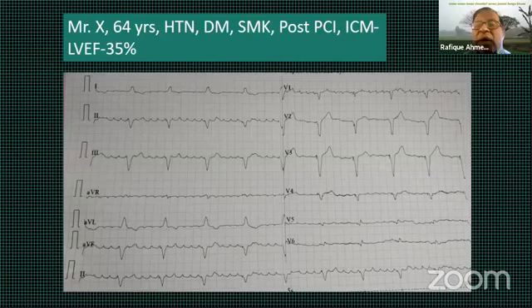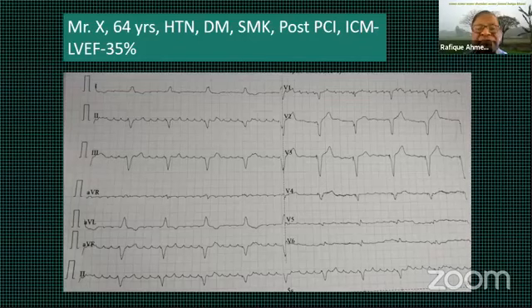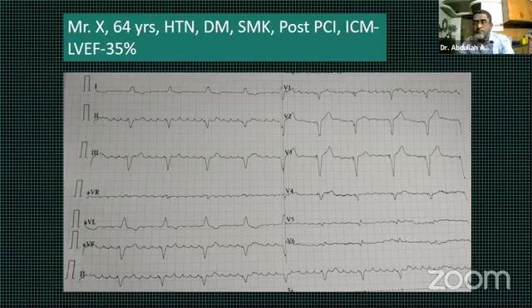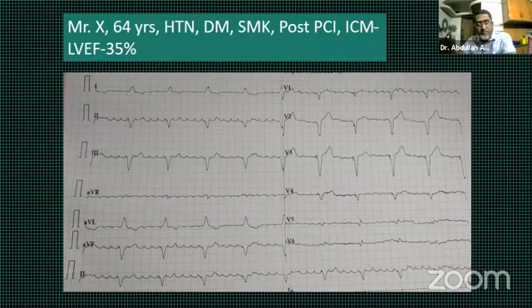But Hafiz, my assumption was this patient already had the ICD, so it must be old. So it must be a chronic cardiomyopathy. Okay, was it an ICD from before or a pacemaker from before? No, it's an ICD. Perfect. Do you have any data before implantation? Single chamber ICD.